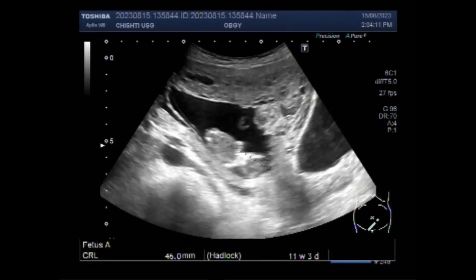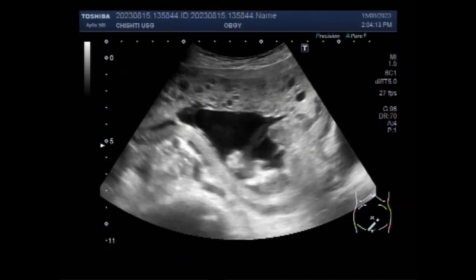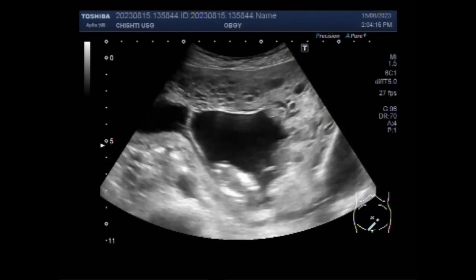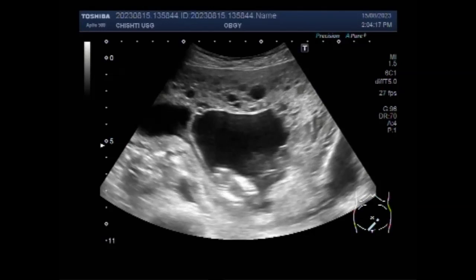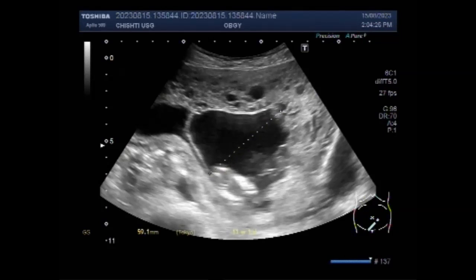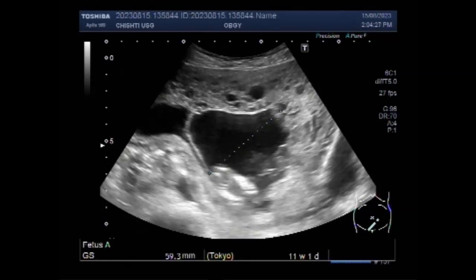You can see both the fetuses and the respective gestational sacs. Now you can see the measurement of the pregnancy — it is about 11 weeks and 6 days. However, there is no blood flow and fetal cardiac activity is also missing.